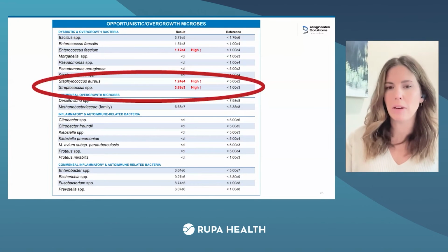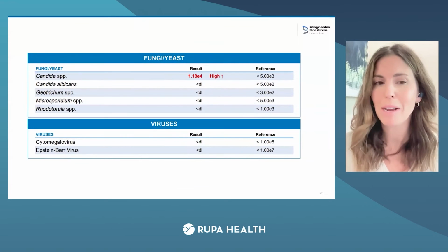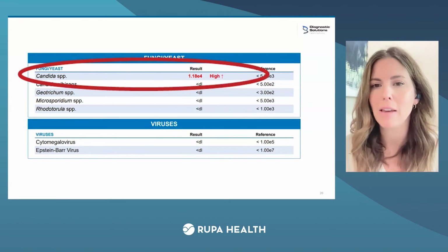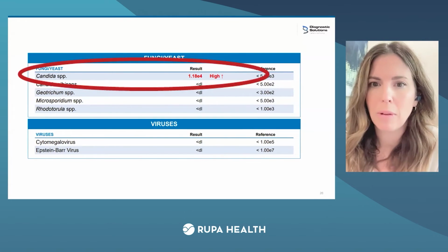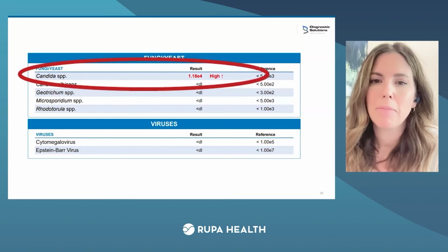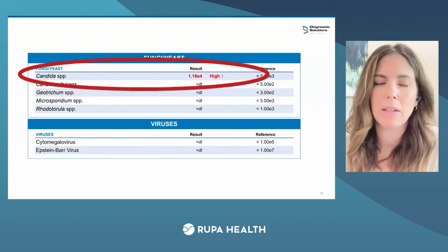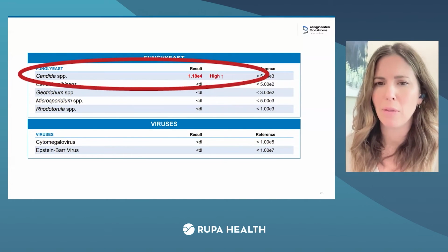Now let's look lower down on page 3. We're looking at yeast and viral infections, and we do have this pretty massive population of Candida. Now the E4 level in our test is significant. And for a child with eczema, this is going to be very significant. So I'm looking at this. This is a pretty persistent organism, so I wouldn't expect this to just be a transient exposure. This is likely to be a bit more chronic, and really affecting barrier function.